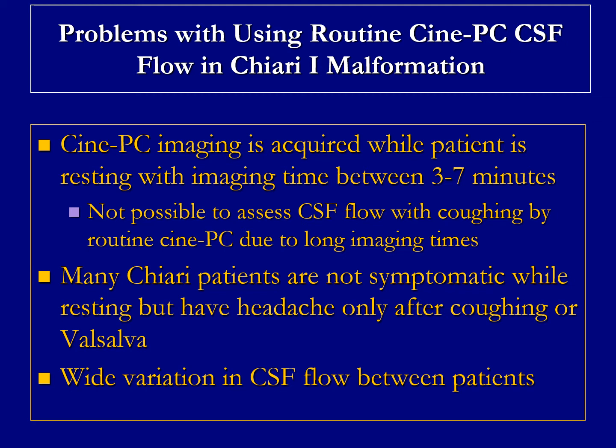It is not possible to assess CSF flow while the patient is coughing by the routine PC method because of the long imaging time. Many Chiari patients are not really symptomatic while resting, so the cine PC technique can only give us the flow related to the heart beating, but not related to the respiratory movements like coughing or Valsalva.